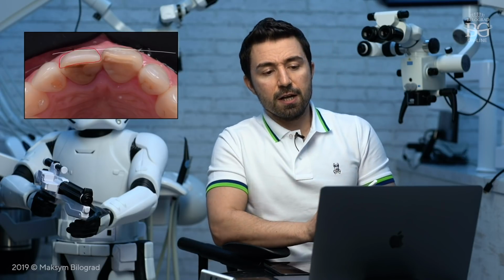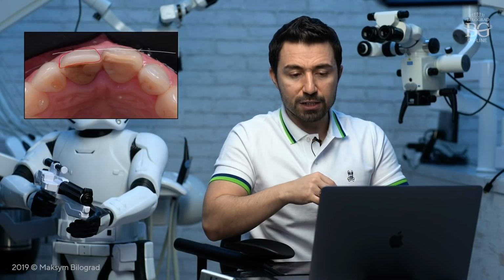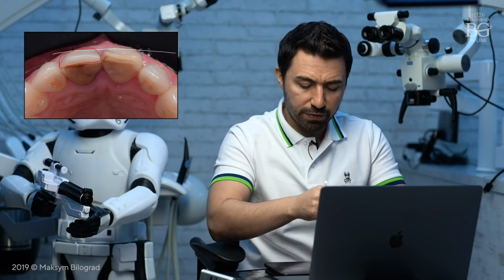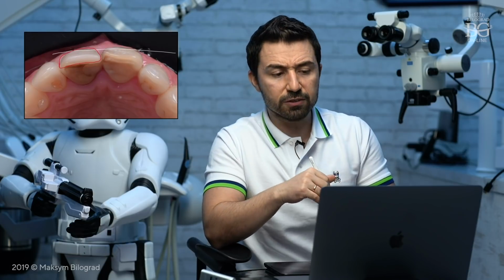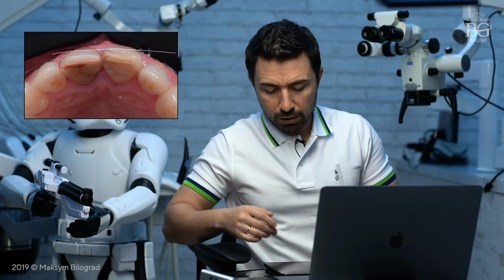In this case, you can see the one even more protrusive, and that has to be evaluated for tooth preparation, and also color change if color change is an issue in that kind of case. So that picture again, the picture taken through the incisal edges of central incisors, will help you to see the position of teeth utilizing an intraoral picture.